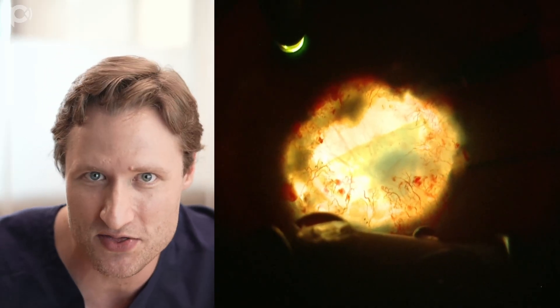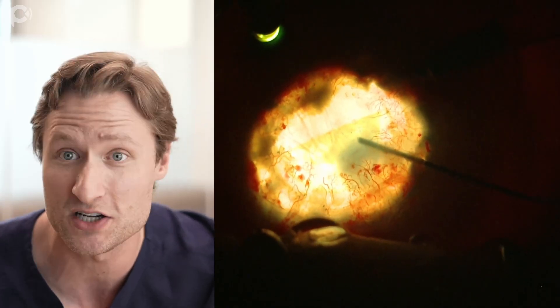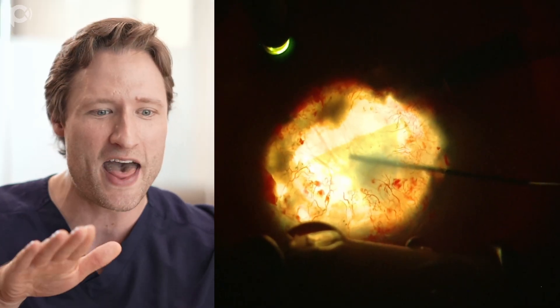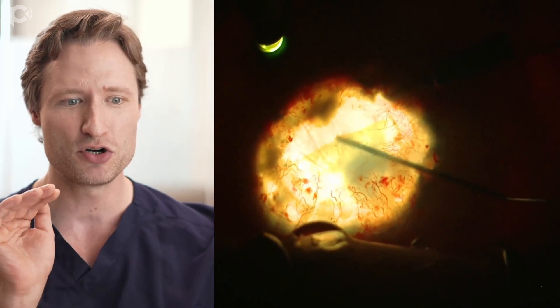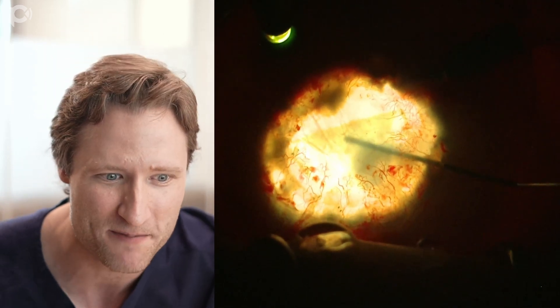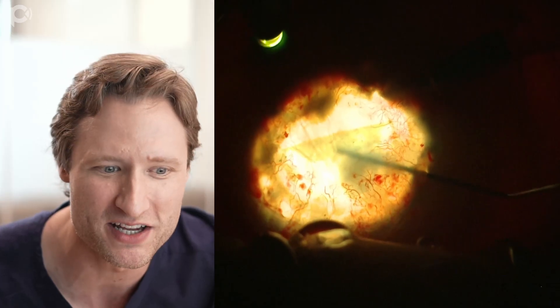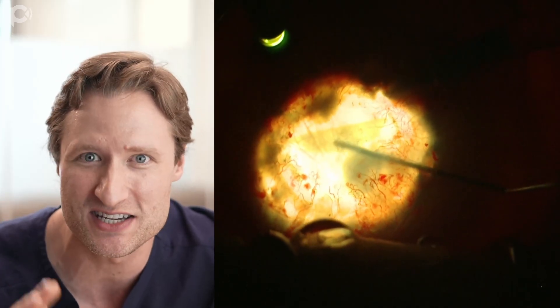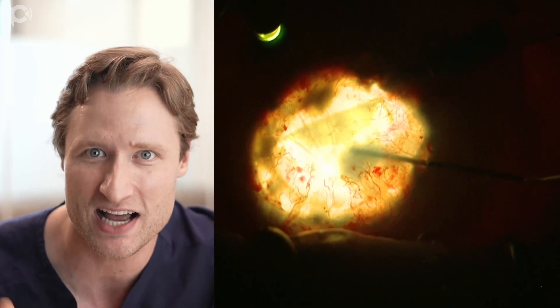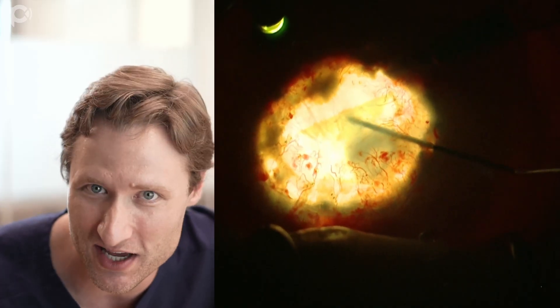The thing that's going to be required is direct manipulation with the cannula. So here, through a paracentesis, I'm trying to get underneath that edge and just push it out - push that edge away from me. And that is remarkably successful. What contributes to the success in this case is that I do not have a tightly scrolled graft.